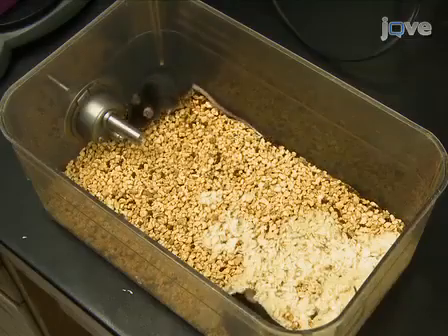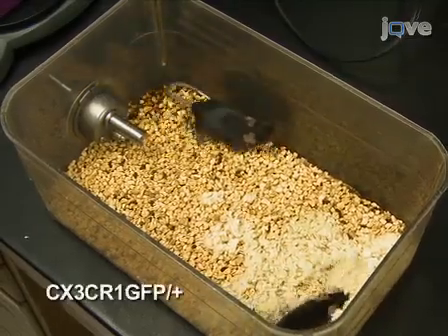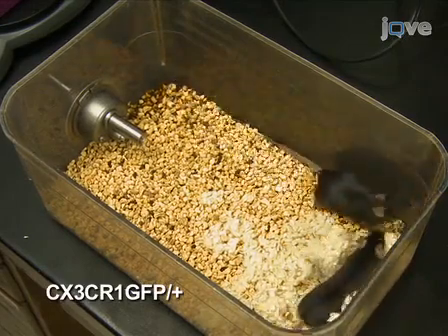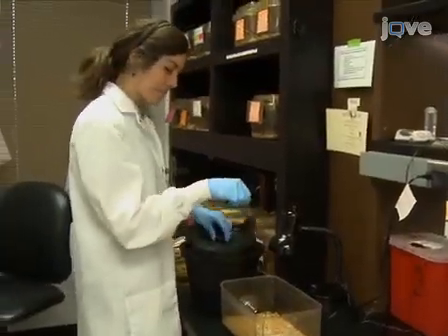Today we will show you a procedure for two-photon imaging using a thin skull preparation. We use this procedure to study chronic neuroinflammation. So, let's get started. In the experiment shown here, mice that express GFP in mononuclear cell lineages, including microglia, are used. Different strains of mice can be used to meet the needs of a specific project.